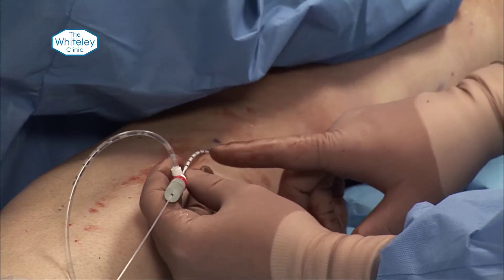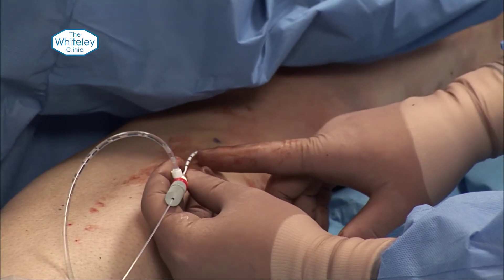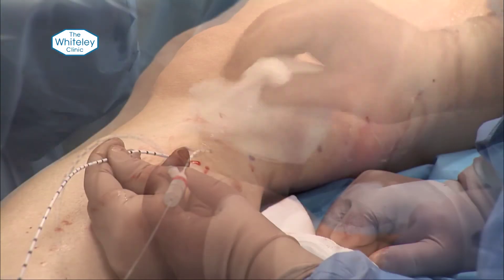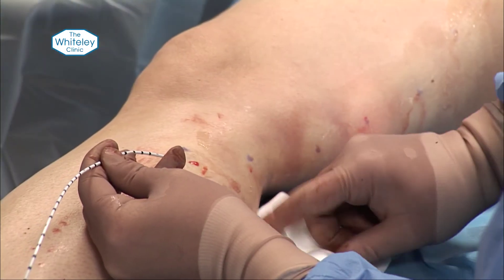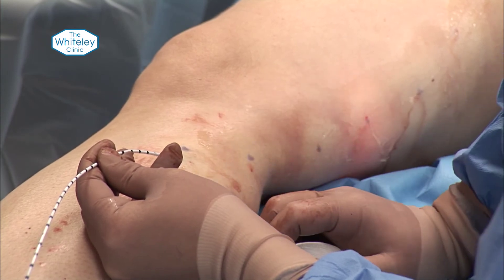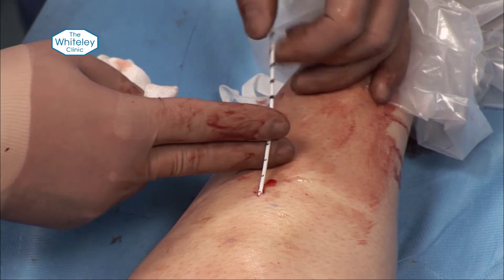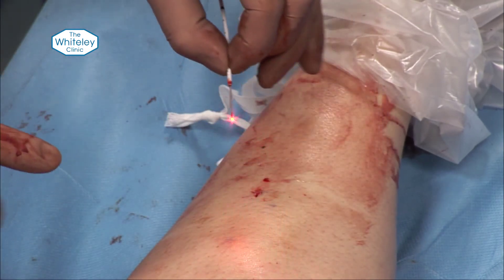We mark on the outside and measure the depth: 50, 49, 48, 47 — so it's 47cm within the patient. We're stopping 1cm short because we know we only got into the vein at the end of the cannula.